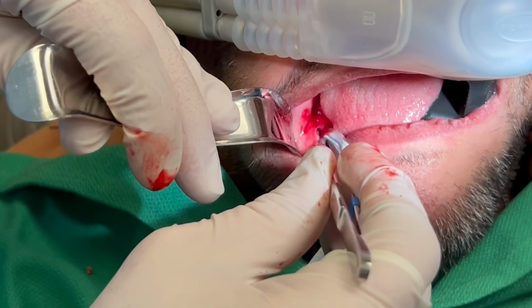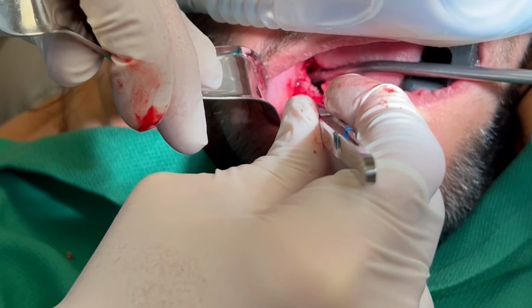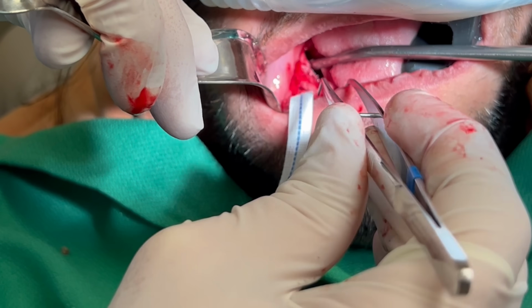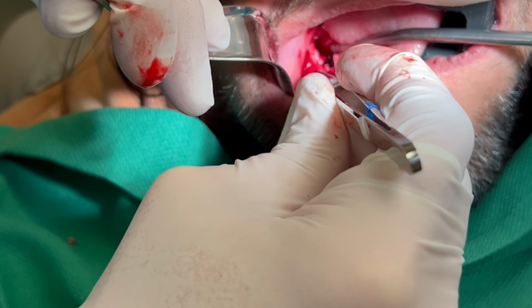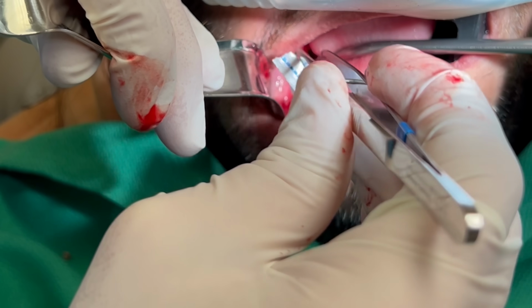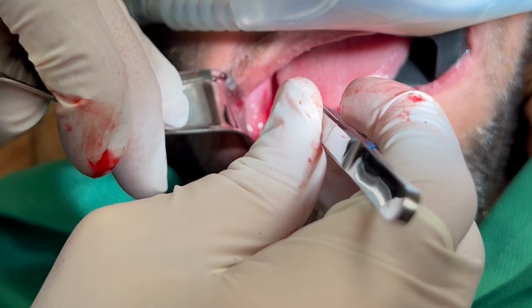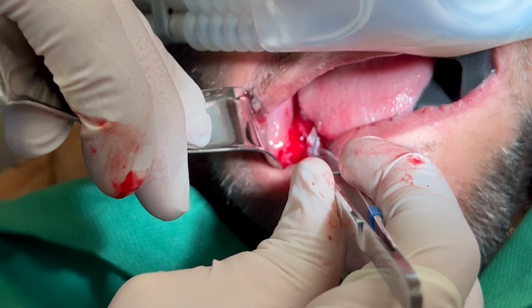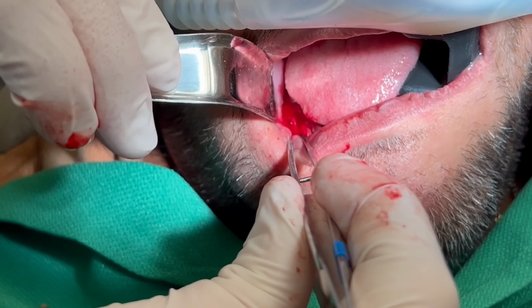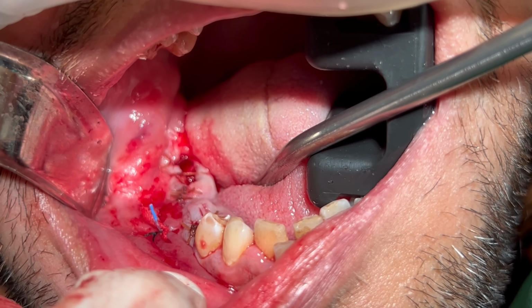The last thing I do is place a packing so that there is no dead space. I don't want this infection to reaccumulate, so I'm going to leave this pack in here for several days and then remove it. The pack is secured and all sites are closed.